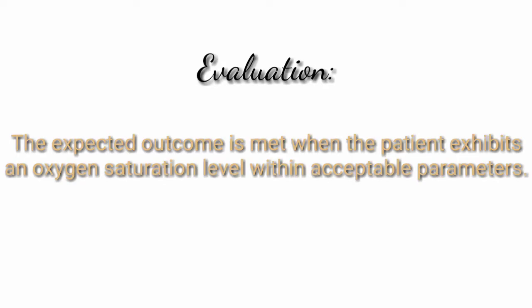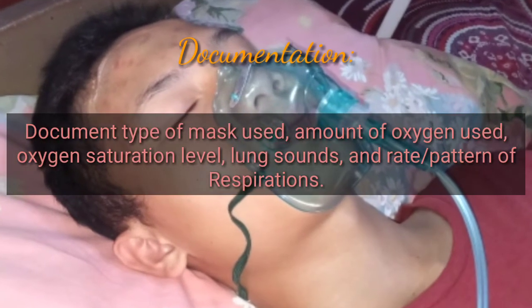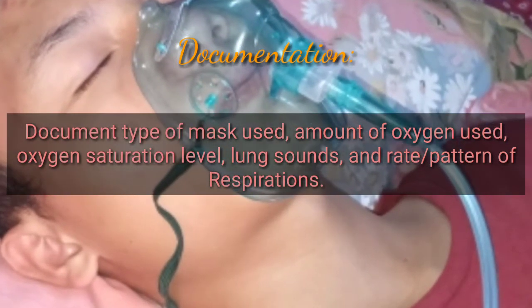Evaluation: the expected outcome is met when the patient exhibits an oxygen saturation level within acceptable parameters. Documentation: document the type of mask used, amount of oxygen used, oxygen saturation level, lung sounds, and rate and pattern of respiration.